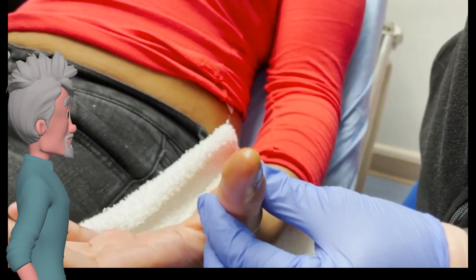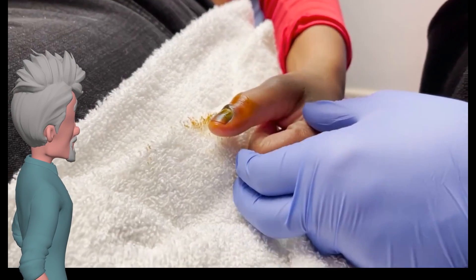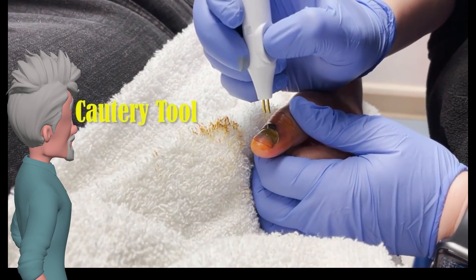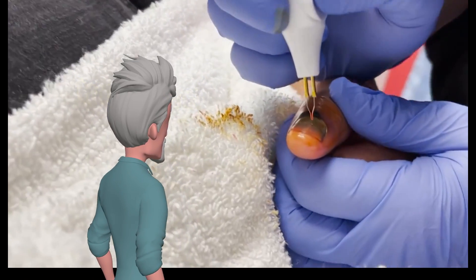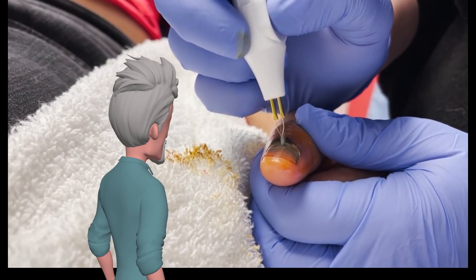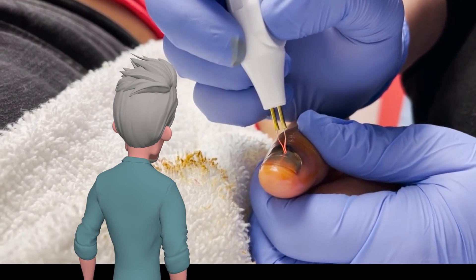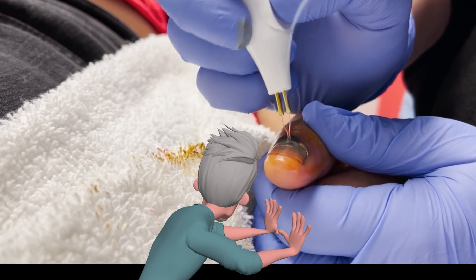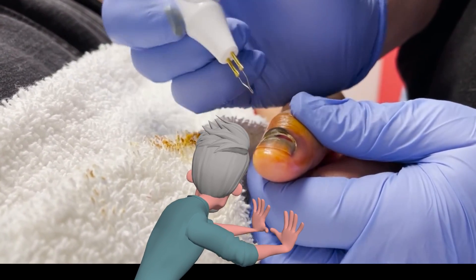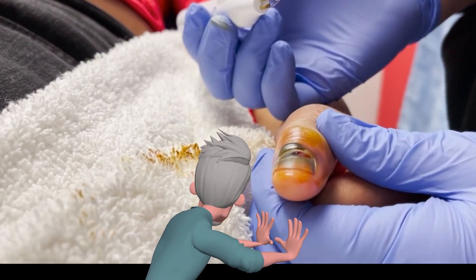Just massage that a little bit. There you go. Okay, you're okay — don't jump. What you might do now is get your 18 gauge since you kind of broke through.